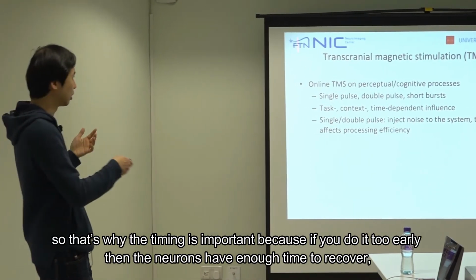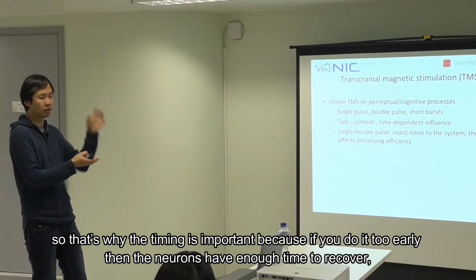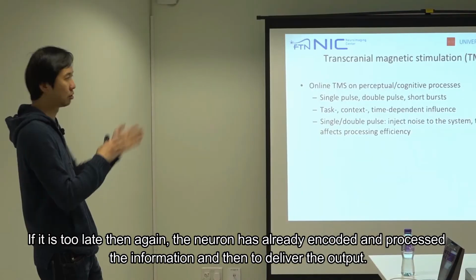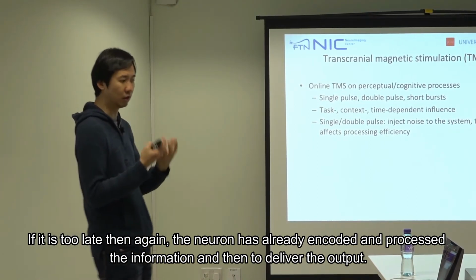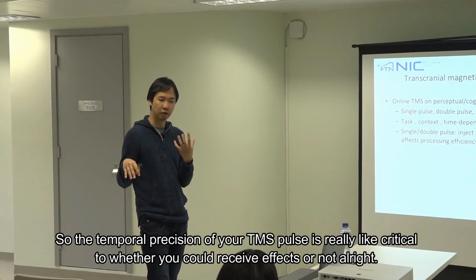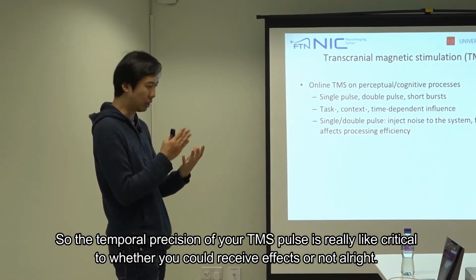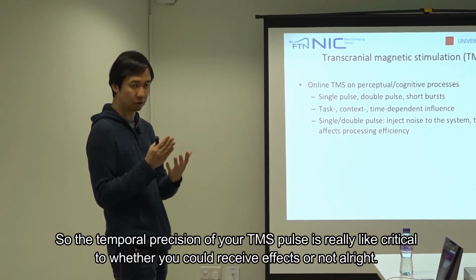So that's why the timing is important, because if you do it too early, then the neurons have enough time to recover and to perform the original function. But if it is too late, then again, the neuron has already encoded and processed the information and delivered the output. So the temporal precision of your TMS pulse is really critical to whether you could receive an effect or not. All right?